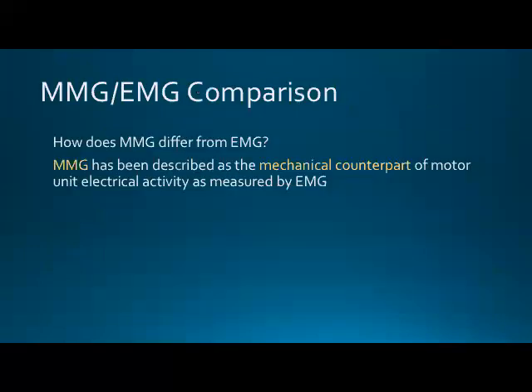So how does MMG differ? Well, we know it's the mechanical counterpart, so it's more of the movement or the mechanics within our muscle rather than the electrical activity, but we can use it hand in hand with EMG, which is really cool.